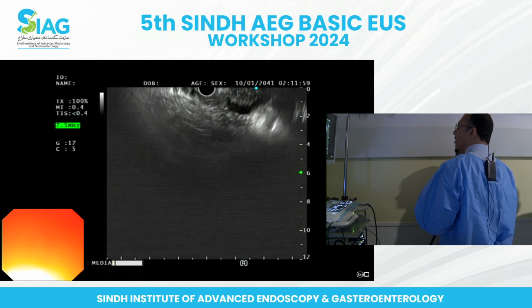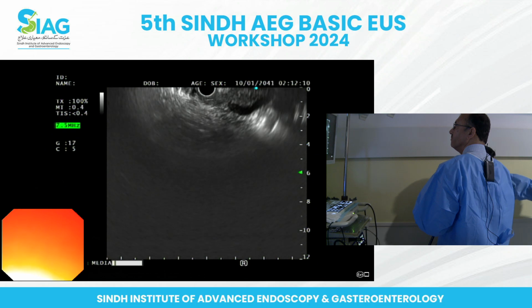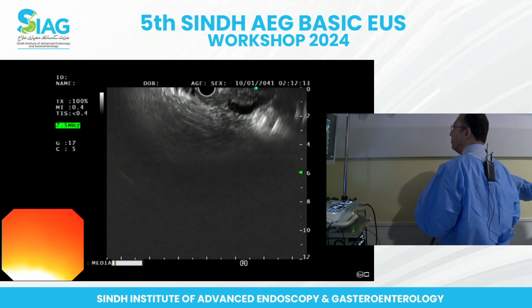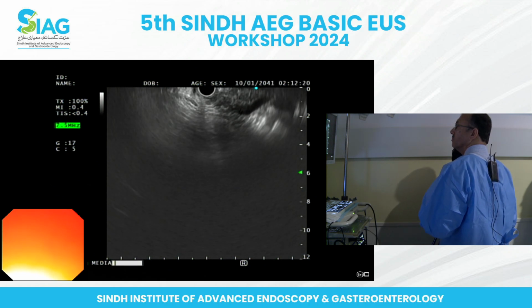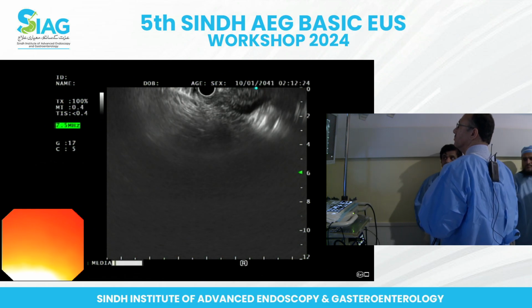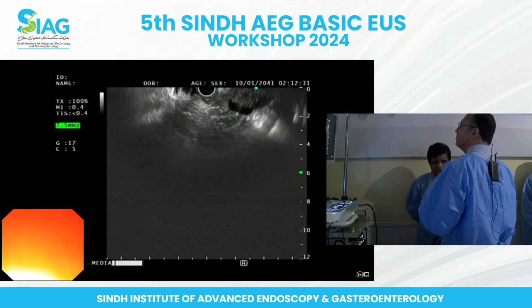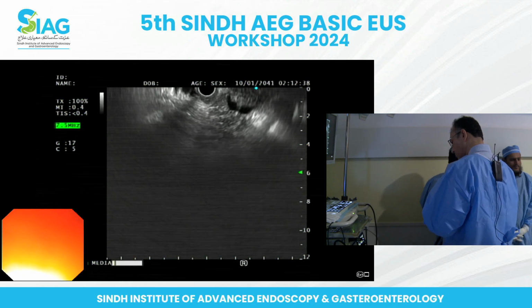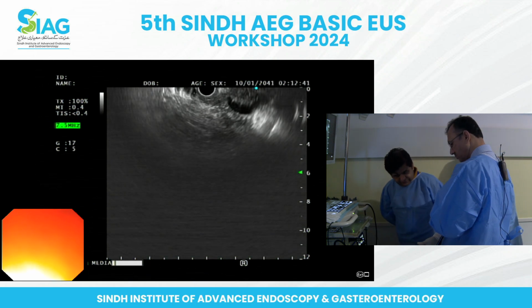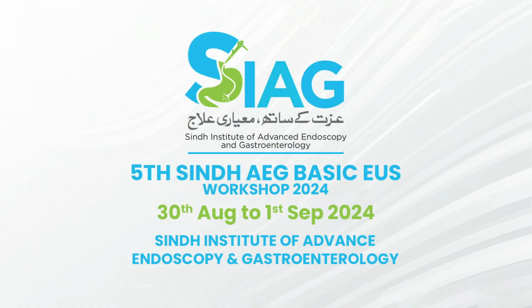Gyas bhai, you are going to move on to the next case. Okay, fine, and I think when you are done, you can finish it. Okay, we are done from here, thank you very much. Please move to the new case. The biopsy has come, see. Akram bhai, the biopsy is done.